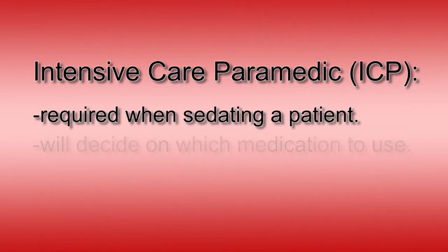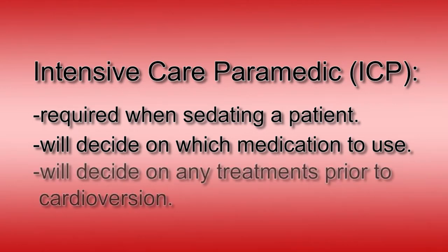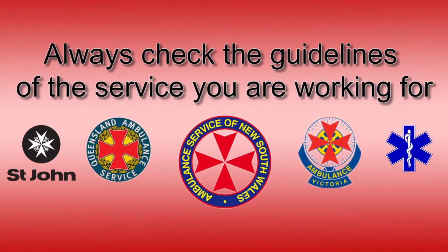The intensive care paramedic will decide on which medication to use and how much, depending on the patient's predisposing history, their comorbidities and any treatment which has been carried out prior to cardioversion. Note that not all service providers will allow paramedics to cardiovert, and this may be relevant to the service which you work for. Some services allow paramedics to cardiovert only when the patient has a lowered motor score component of their GCS. You are now ready to start.